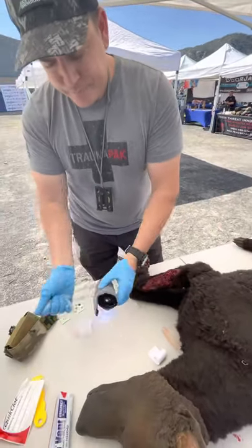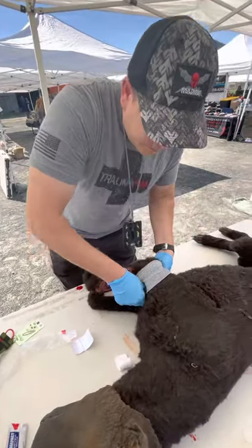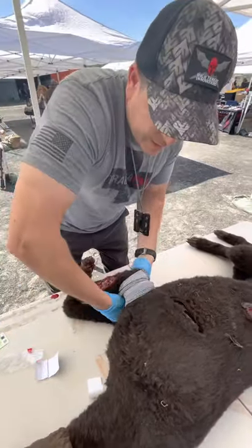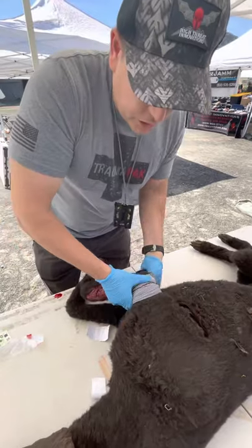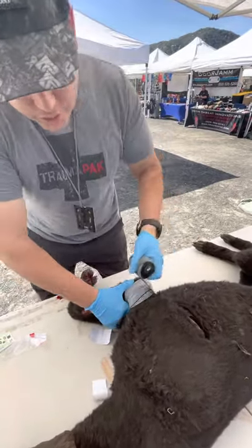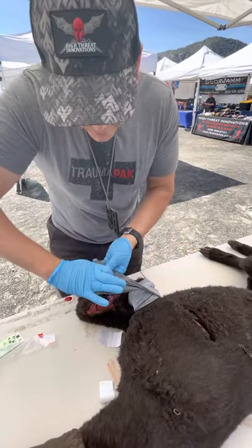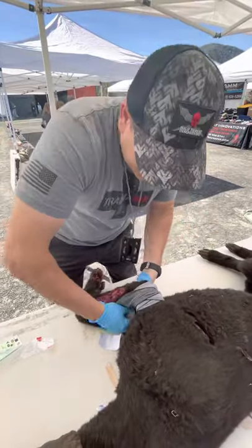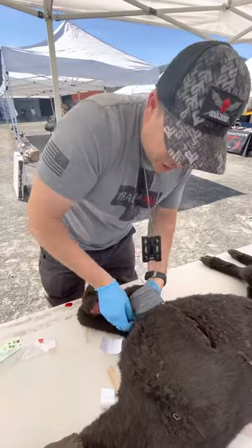Open that up and we're going to start wrapping this right in here, kind of deep in that pocket. As I get this, I'm going to pull nice and tight — similar concept with the SWAT-T. We're going to try to capture the largest amount of surface area, and even that alone will start occluding this. If you want to get extra pressure, you can do a little flip in here like that, and I'm going to keep tightening this all around to get as much pressure and occlusion as I can.